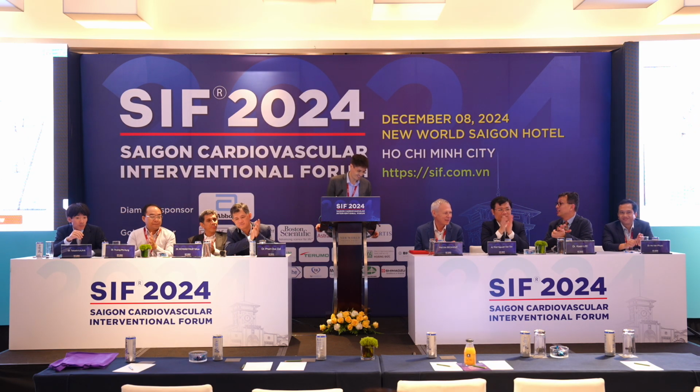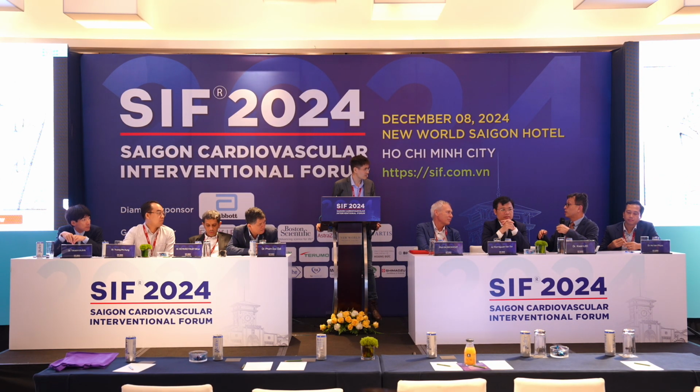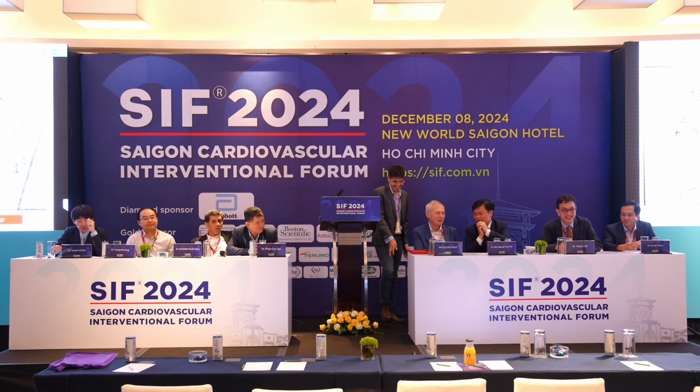Thank you. Yeah. Okay. And I think it's nice that you had a chance to CT size, even in the setting of cardiogenic shock. I was talking to the guys from Nanjing, and they told me that actually 20% of their TAVRs are in the setting of cardiogenic shock, where they don't use CT at all. They just use TE guidance, and they just put the TAVR up without any kind of CT planning. So it's nice to have the luxury of a CT to plan. We are not that skillful. I cannot do anything without CT. Yeah. Thank you so much.